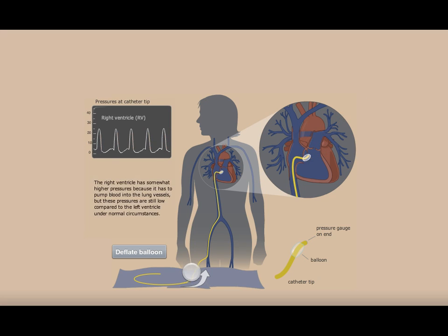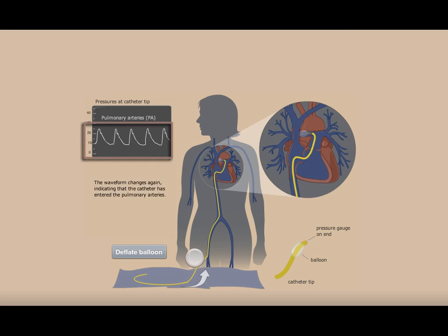As you move the catheter into the pulmonary trunk and pulmonary arteries, you can see the pressure waveforms change again. The pressure no longer falls as far during diastole, compared to the RV pressures. On this side of the pulmonic valve, as opposed to the RV side, the closure of the valve maintains pressure by preventing blood runoff back into the RV.